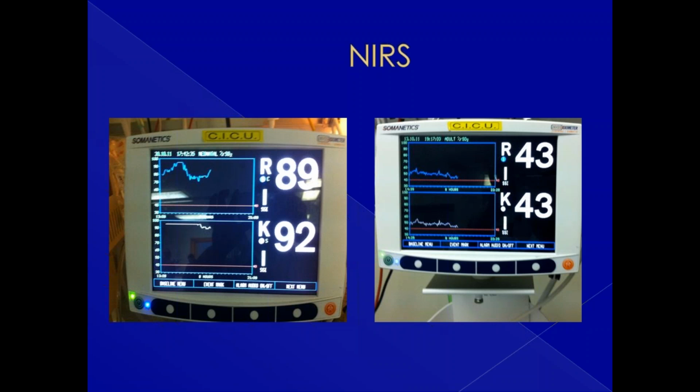Okay, and so there are two situations here on a couple of our patients who were on ECMO. Here you can see there was one patient with somatic saturations of 92 and cerebral saturations of 89. Are you happy with these numbers? Systemic saturations are okay, 92 acceptable, but cerebral saturations are high, 89. So there is no extraction taking place. Brain is not in a condition to extract oxygen. So it is a worry.